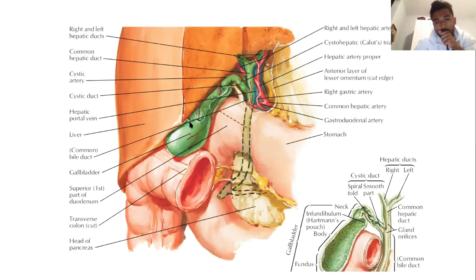So that was a transverse cut of the gallbladder. Now, do you know what the porta hepatis is, Kenny? No. It's this connective tissue area to the inferior portion of the liver where you have your portal triads entering.